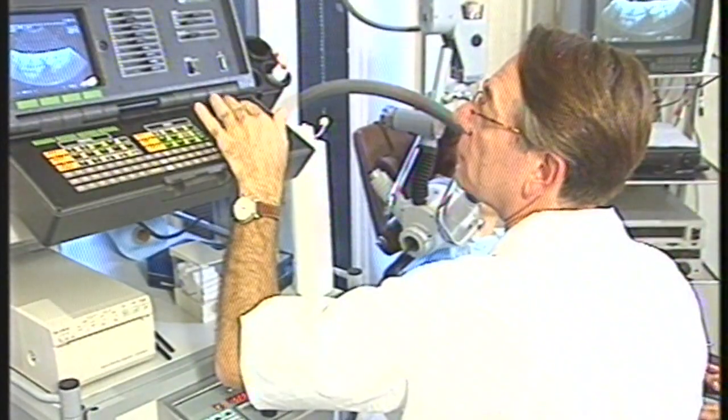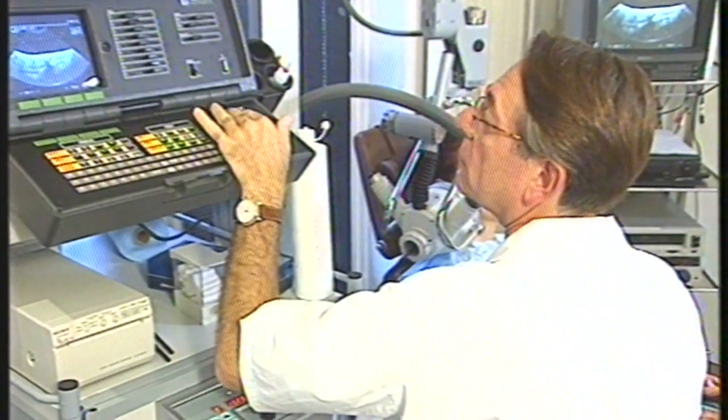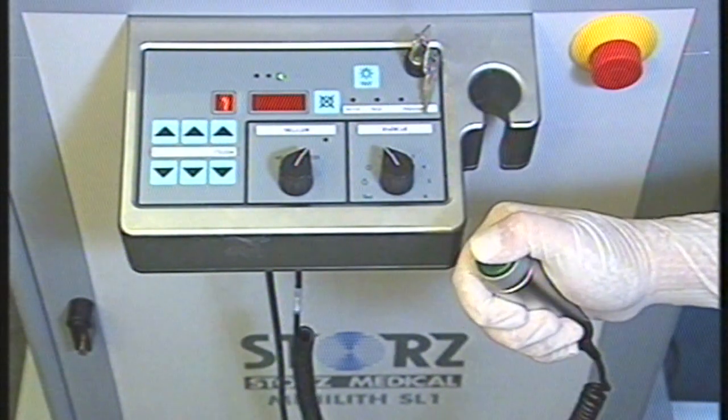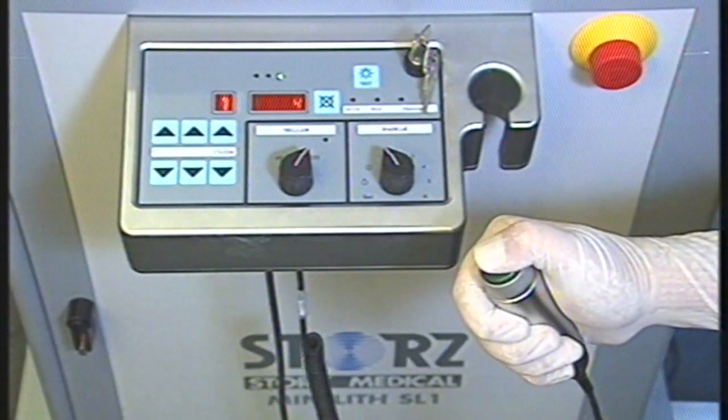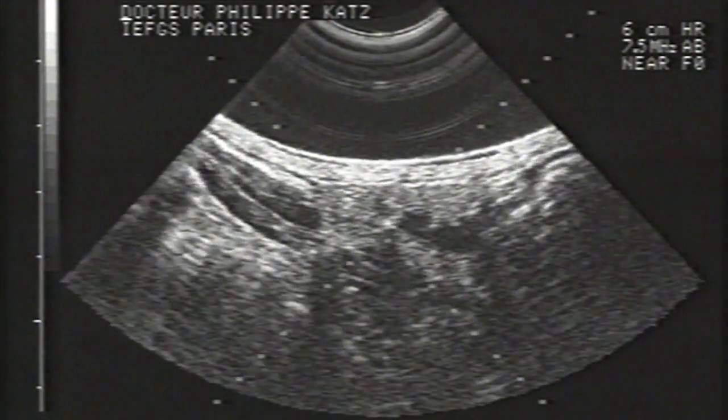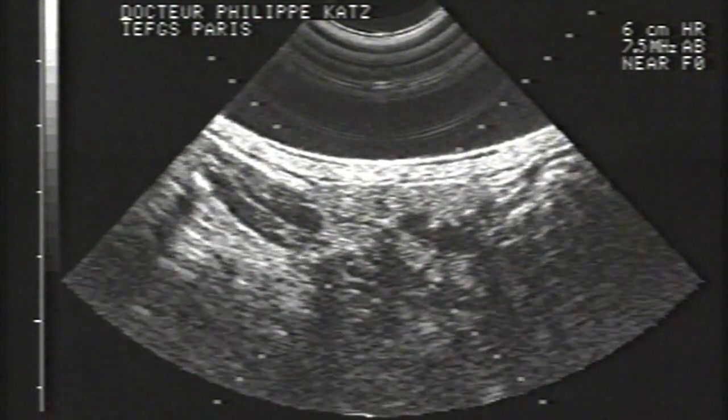The intensity is adjusted by a control knob graduated from 1 to 6. To start, intensity 1 must first be selected and can then be increased and adapted to the patient's acceptable pain tolerance while yet remaining efficient for fragmentation.